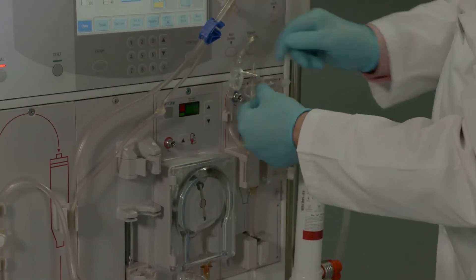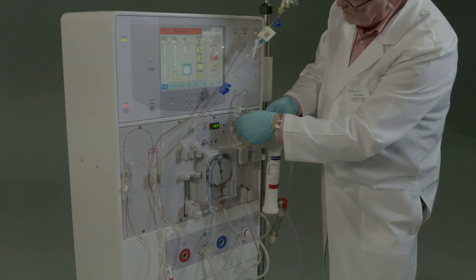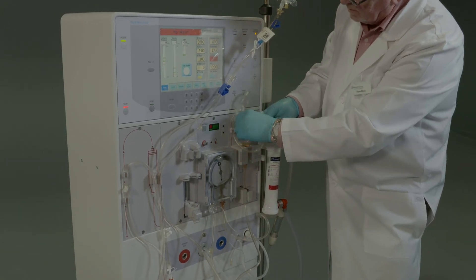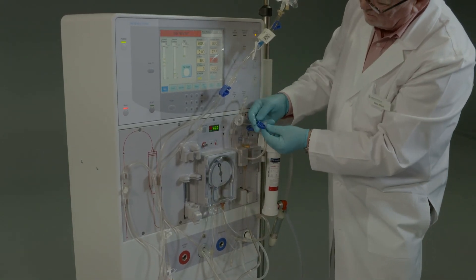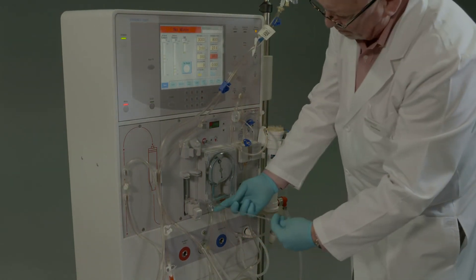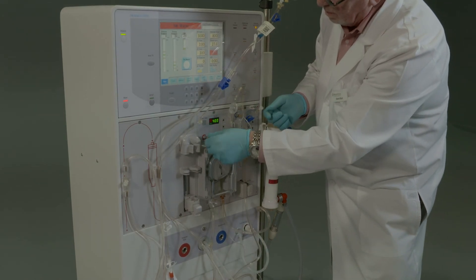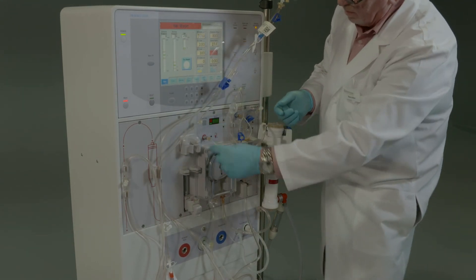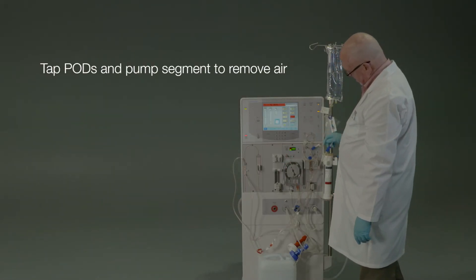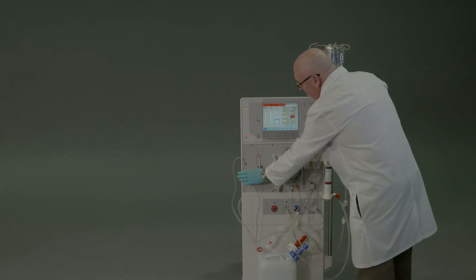Attach pod monitor lines to machine pressure ports and open clamps. Start the blood pump. Ensure all air is expelled from the blood tubing set. Gently tap the arterial and venous pods.